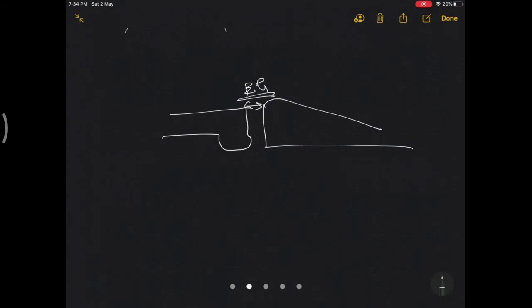So if everything is normal, then this should be around 18 mm, replacing 9 mm of femur and 9 mm of the tibial side. If preoperatively there is a correction of the valgus and there are no issues with the soft tissue balancing, you will take a 9 mm cut on the tibia, a 9 mm cut on the femur, and it is assumed that the extension gap should be around 18 mm.